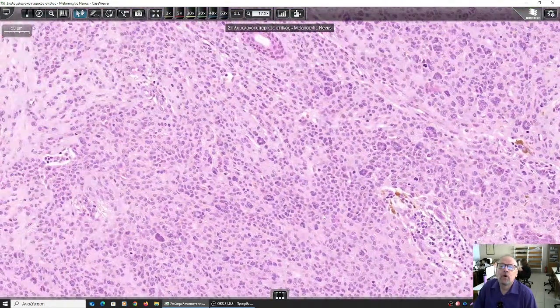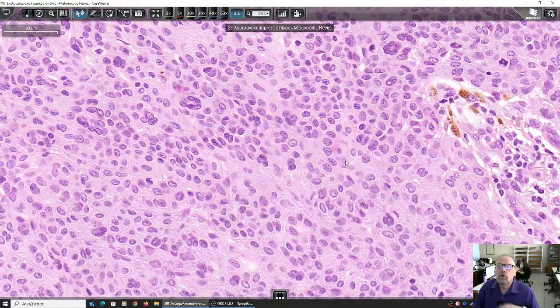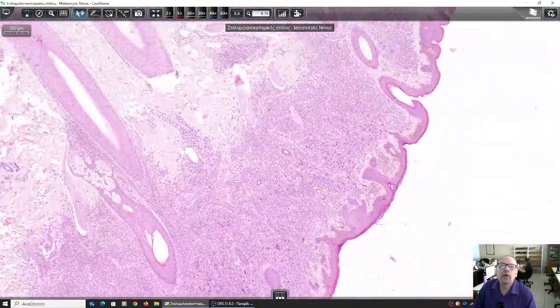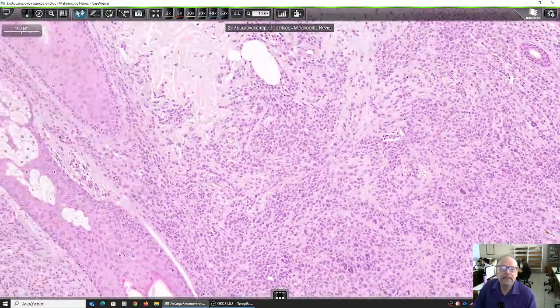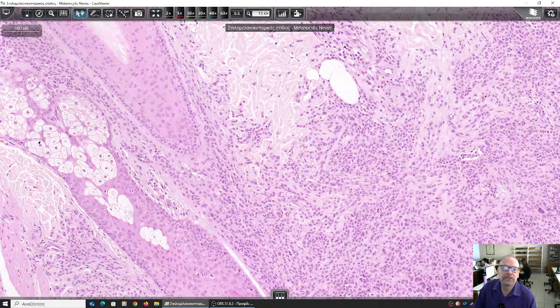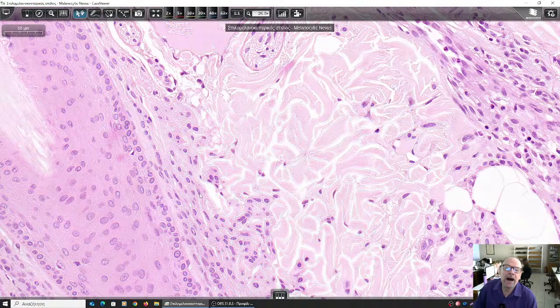Look here, they look quite the same, one to each other, and more importantly, as we go to the deeper parts of the nevus, the intradermal nevus, because the nevus cells are within the dermis, we can see that they grow somehow smaller.